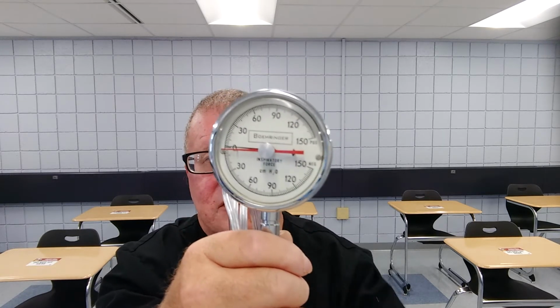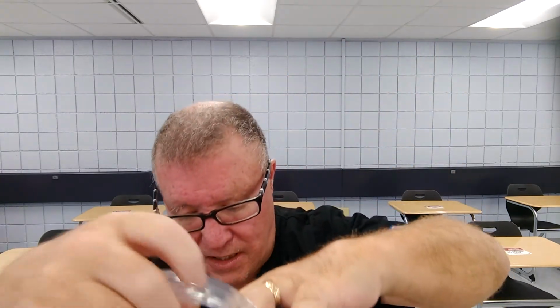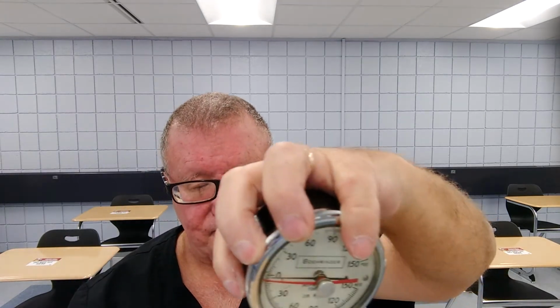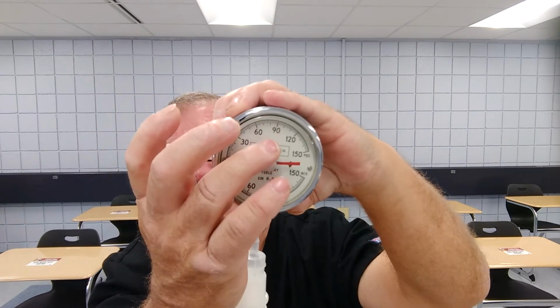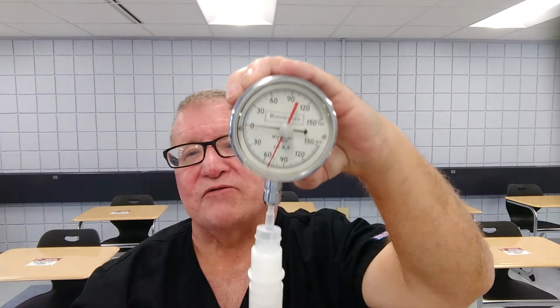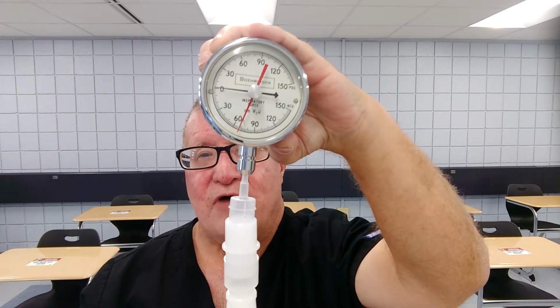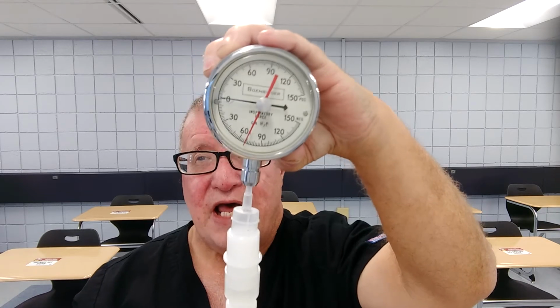Now what it is, you have the patient suck in as fast as they can. I'm going to do it once. Well, I don't have it connected. Okay. You have them suck in as fast as they can. The black needle pushes the red needle down, okay? And then I would look and I would read the red needle, and that's going to tell me what their NIF is.